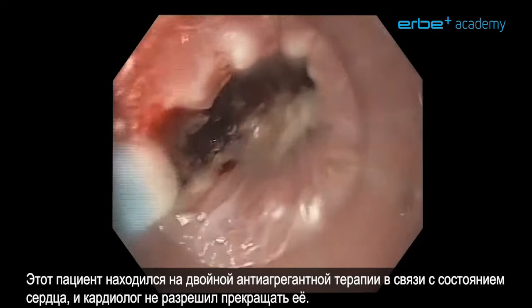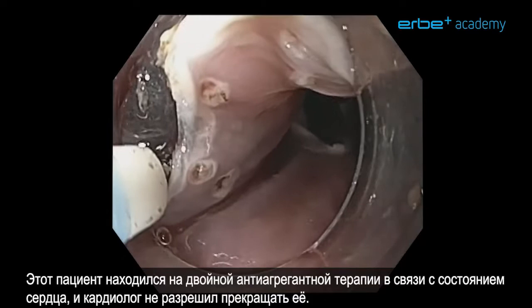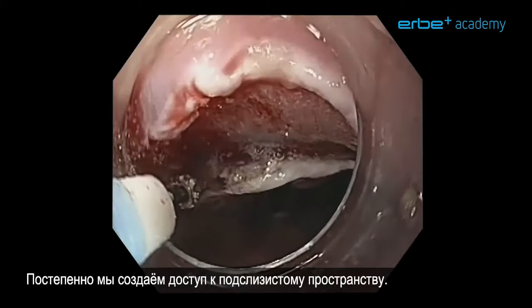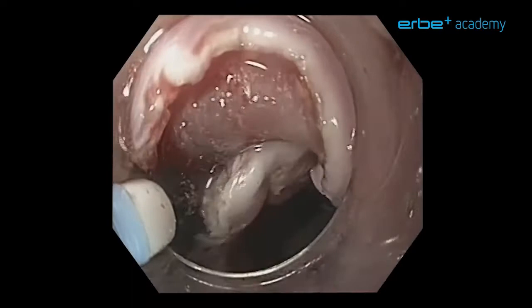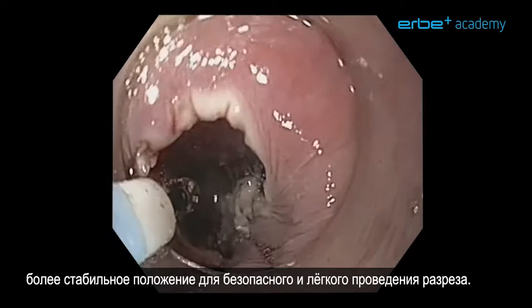You will notice quite some bleeding. This patient was on double platelet aggregation blockers because of a heart condition and we were instructed by the cardiologist not to discontinue this, so we accepted this at the expense of a little bit more bleeding. Slowly here we are creating access to the submucosal space, treating some bleeding before we continue. Once we have access, we can crawl in using the cap to crawl under the lesion and you will find yourself in a much more stable position to do a safe and easy cutting.